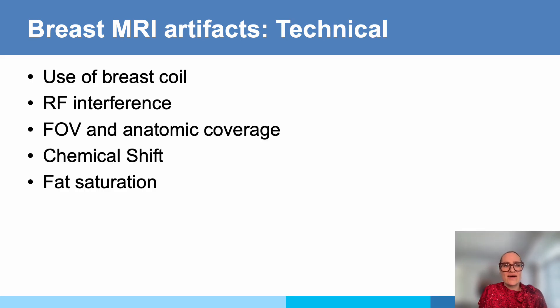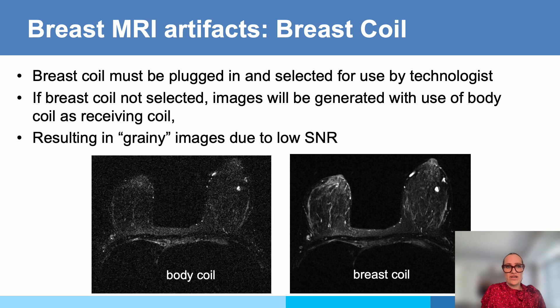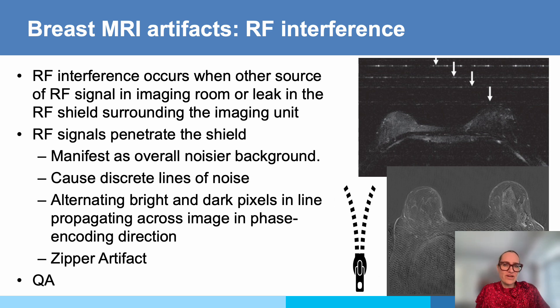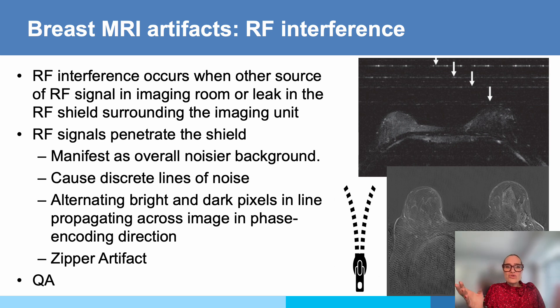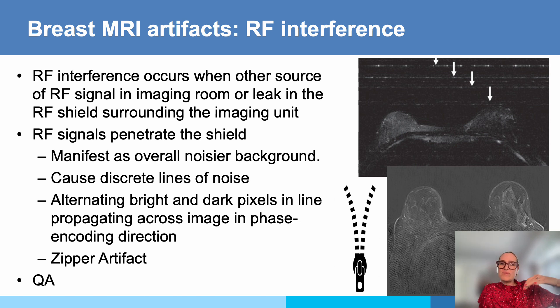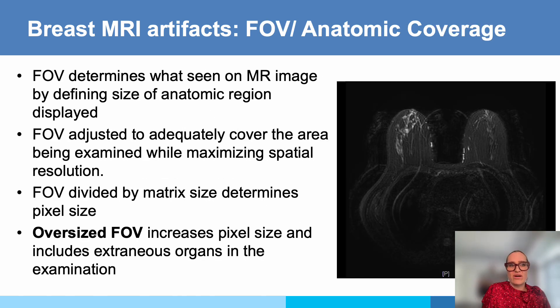Technical artifacts are related to coil, RF interference, and coverage. Make sure the breast coil is plugged in — if you use the body coil it will give you a grainy image due to lower SNR. RF interference presents as zipper artifacts running across the image, meaning there is damage to the Faraday cage — usually an open door or a lamp left too close to the magnet from biopsy use. This can usually be easily addressed when you see those zipper artifacts.